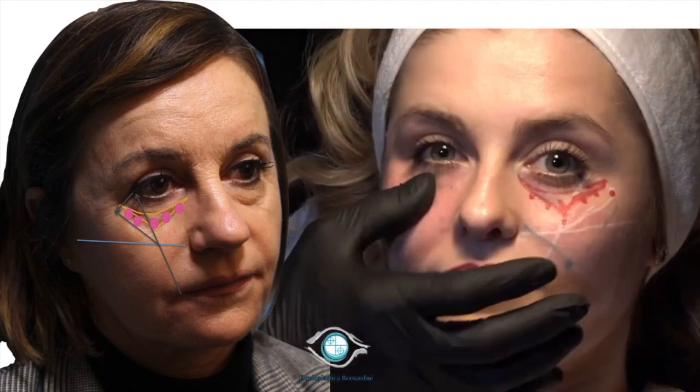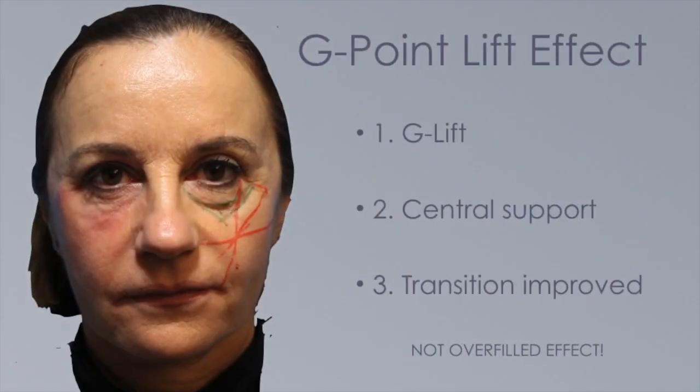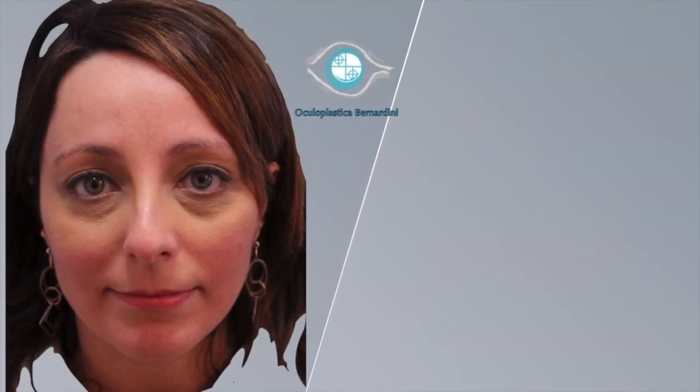complication. You see the patient, the treated side compared to the untreated side, in which she appears much lifted, supported, stretched, and she's happy to look at her treatment in the mirror. So you can also see in this pre and post, one side and the other needed treatment, and the final results before and after, the changes in bags, troughs, skin, and cheek support. So these are, I think, improved treatment, expanded indication, and reduced complication rates.